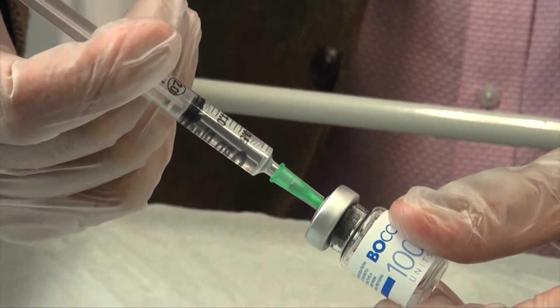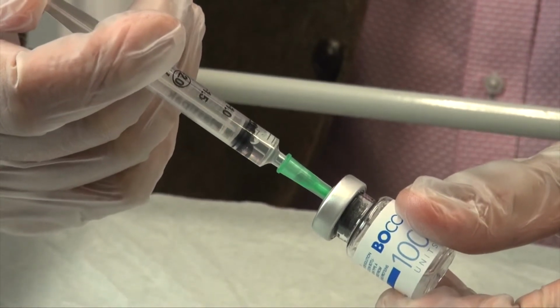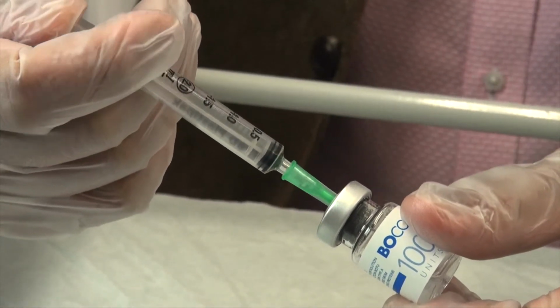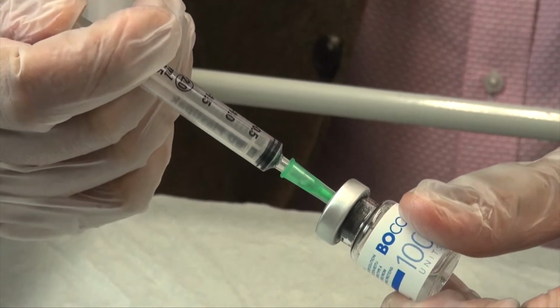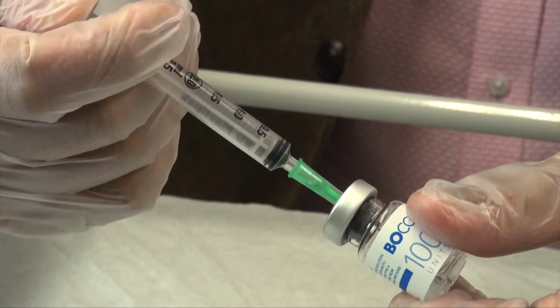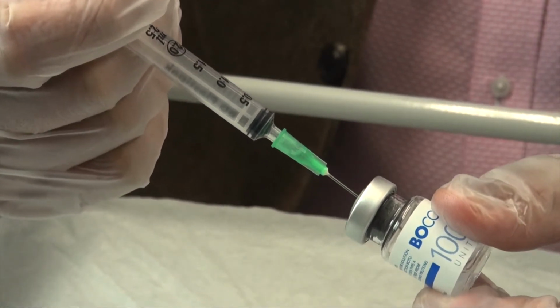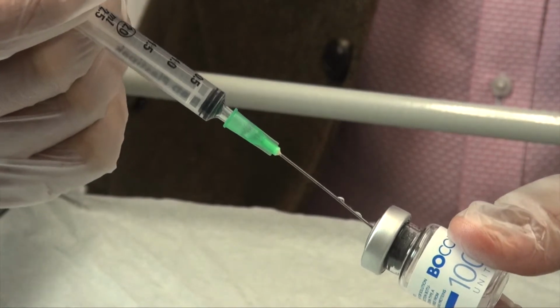So in order to avoid this inadvertent loss of toxin, we shall push it all back in and keep the thumb firmly down on the plunger and retract the whole apparatus from the vial.